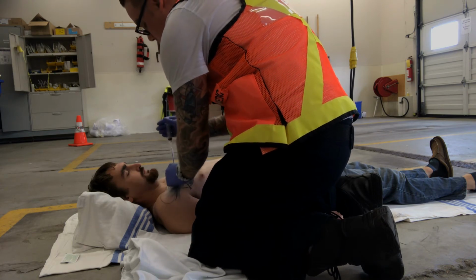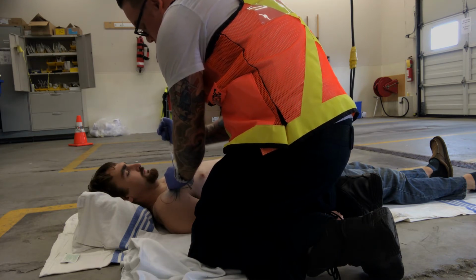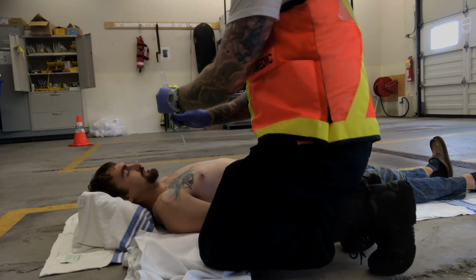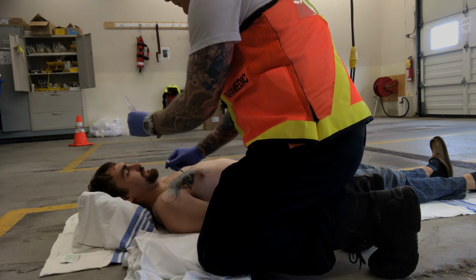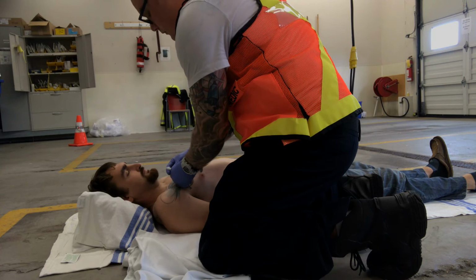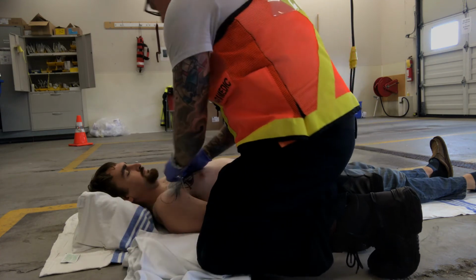While I'm pushing down with the needle, I'm going to slowly apply negative pressure. I'm going to look for bubbling. Once I see that bubbling or blood, I'm going to advance the catheter and remove the needle. I've removed the needle, and I'm going to hold this in place.